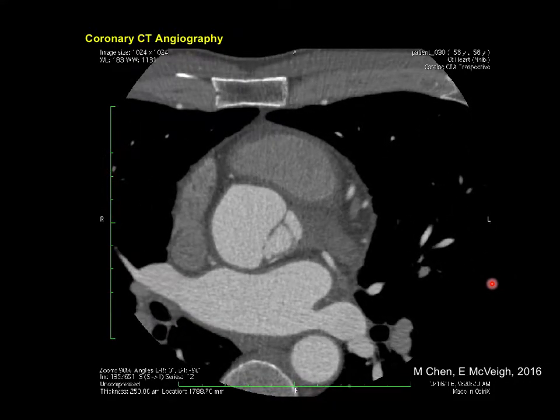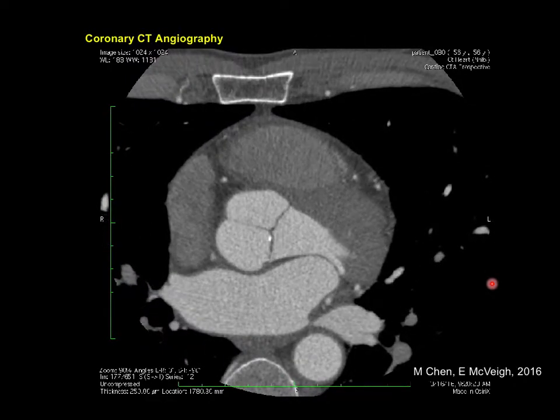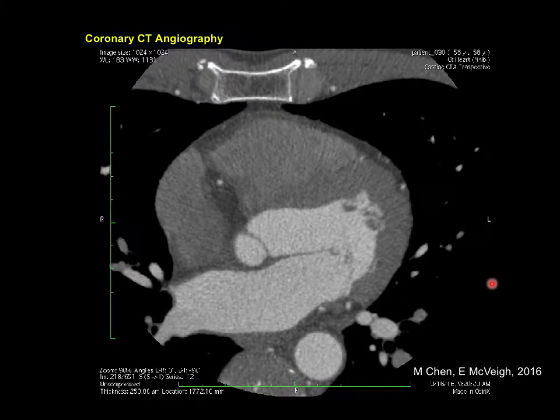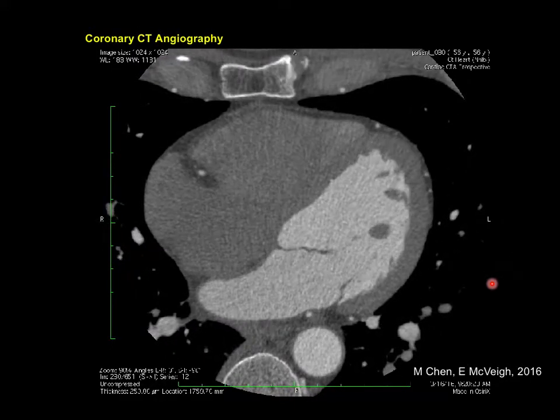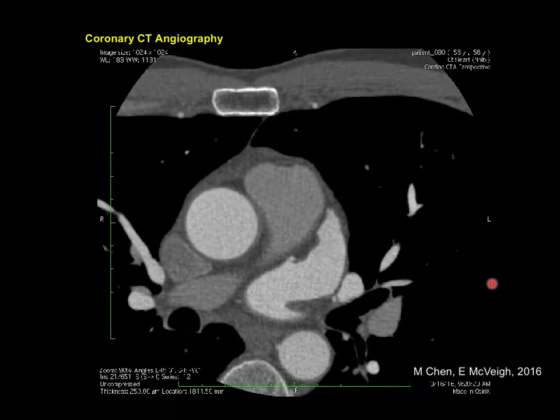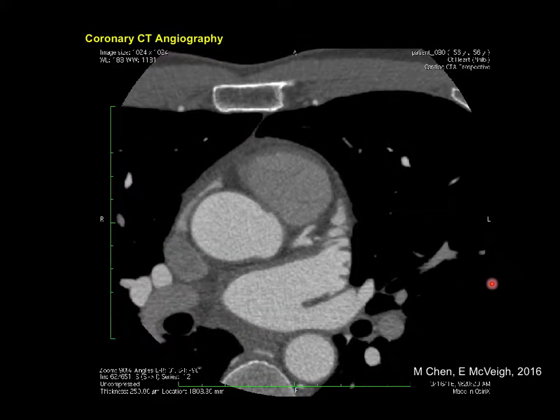This is a new scanner that has been released by Canon, which used to be Toshiba. Toshiba, the company, got into some hot water, and they had to sell off some of their companies, and one of them, a very valuable one, was Toshiba Medical Imaging Systems. So they put that up for sale.